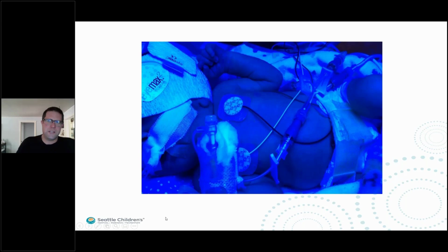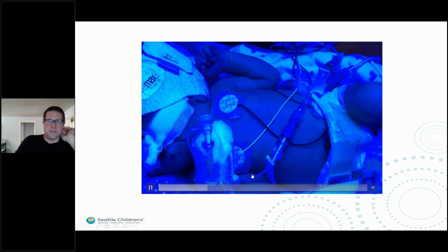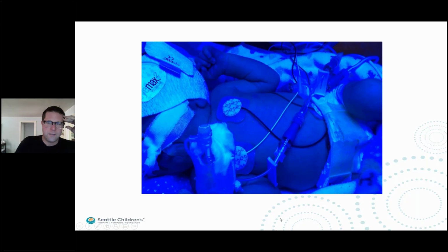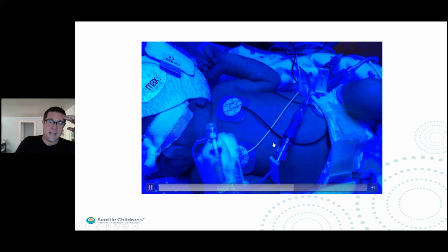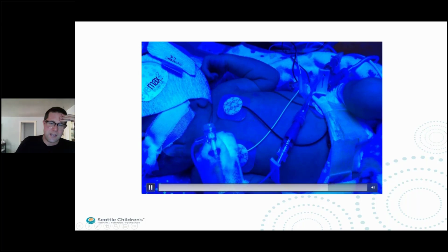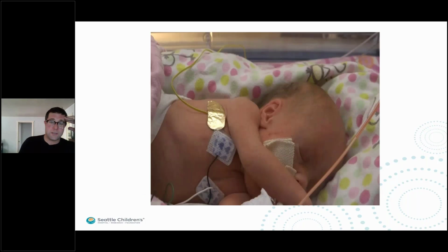So this is what asynchrony looks like, right? Normally, we shouldn't see a patient struggling on a ventilator, and this is a patient that is in fact struggling on a mechanical ventilator. Every time they try to initiate a breath, their chest wall is sucking in, they're creating retractions, and there are high pleural pressures being generated. That is not how patients should look when they're being supported by a ventilator. And if they do, then that's really on you as the clinician.